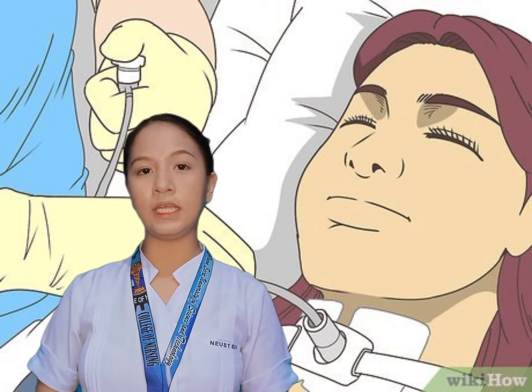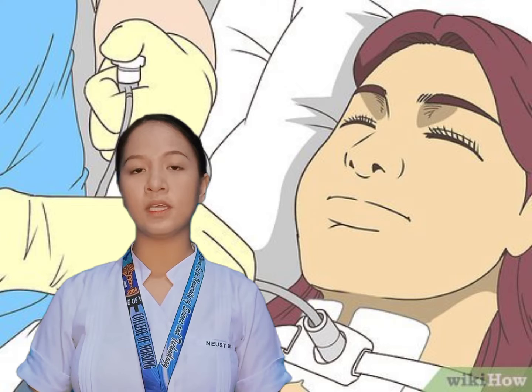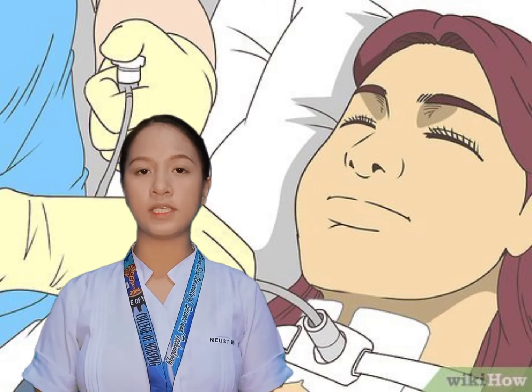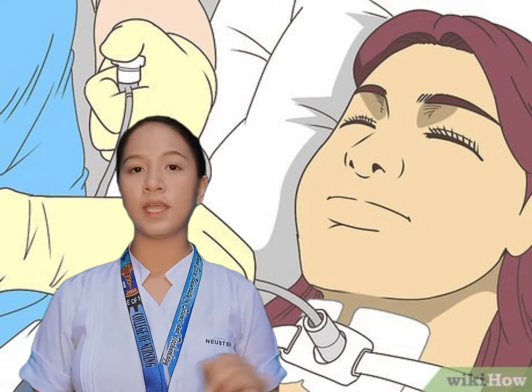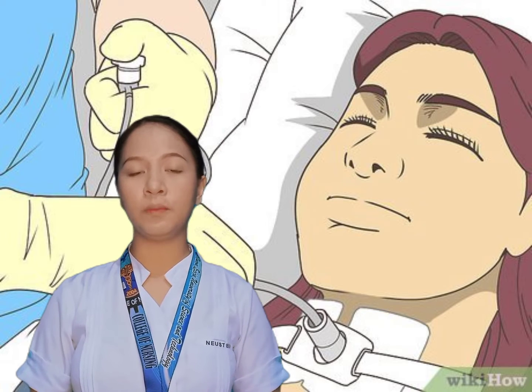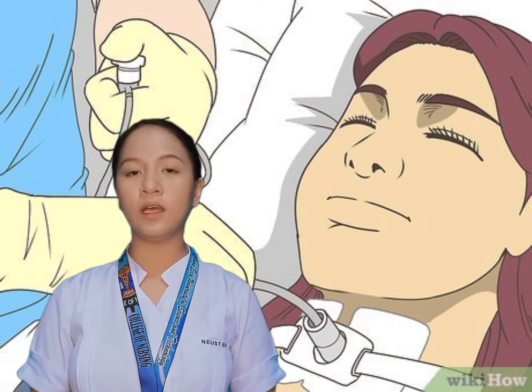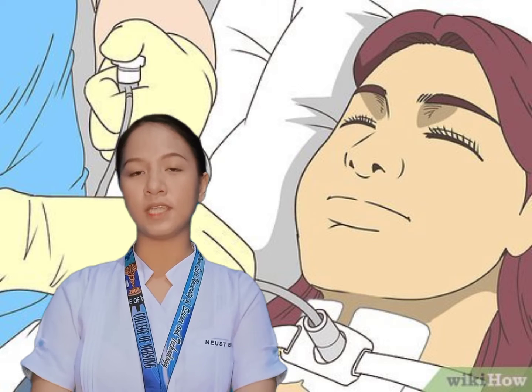For the equipment needed, we have to check first for the bedside table, the towel, tracheostomy suction supplies, sterile tracheostomy care kit if available, or two sterile 4x4-inch gauze pads, sterile cotton tip applicators, sterile tracheostomy dressing in pre-cut and so on, surgical dressing, sterile basin, small sterile brush, pipe cleaner or disposable inner cannula, small brush, roll of twill tape, tracheostomy ties or tracheostomy holder, scissors, pulse oximeter, stethoscope, clean gloves, 2 pairs, mask, goggles or face shield, hydrogen peroxide, plain NSS or sterile water.